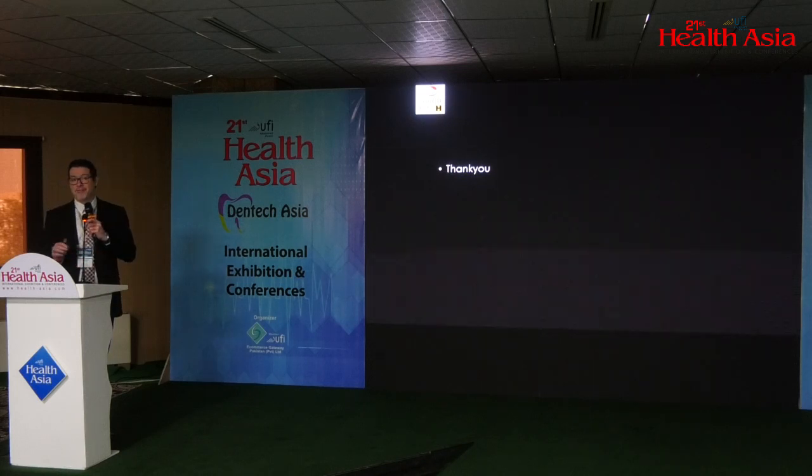So this is just a very, very brief summary, especially for the residents, to try and simplify how you can look at patients who have rectal cancers and how you can simplify your assessment subsequently.